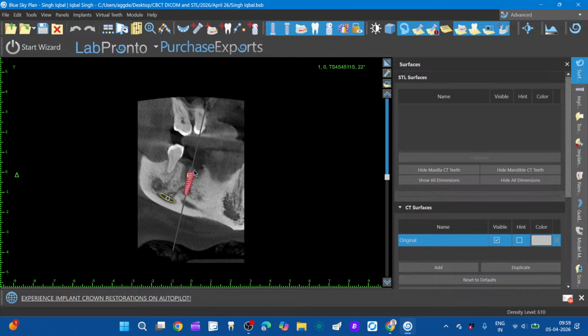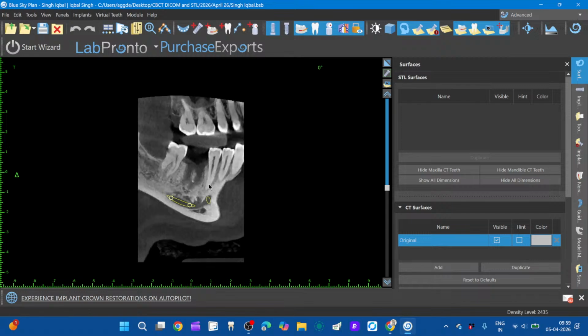So in the interdental area, interradicular area, you will be having some good bone, this area, 1421, and our implant should go into this direction only. So we might be using the asset kit, we'll be drilling just one hole and then expanding the bone there.